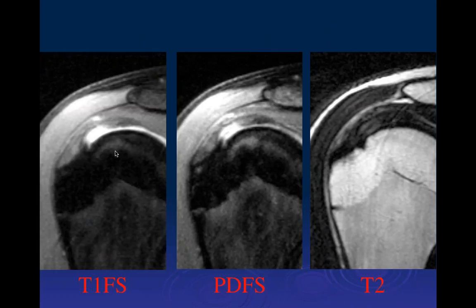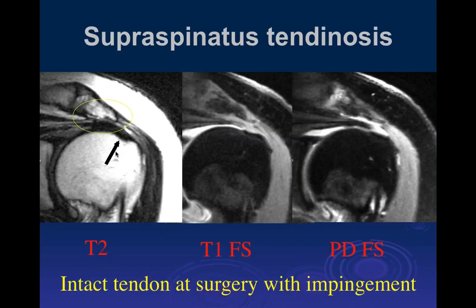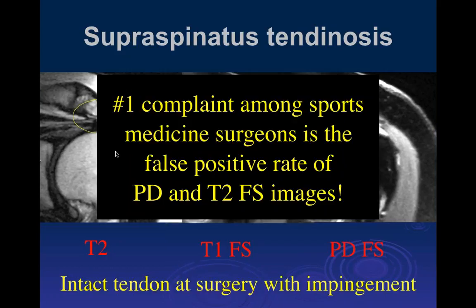Okay, but yes, John. That's why I don't like arthrograms, John. Yeah, and I agree. I'm not a big fan of arthrograms for a couple of reasons. One is I don't think that they help the diagnosis. Some people believe they increase the sensitivity, so people who really want to operate like to order a lot of arthrograms, and we can see that they can increase the false positive rate, I think, more than anything else. But also, if you don't need to, I don't like the idea of putting foreign substances into patients. And why stick a patient and do an injection if you don't have to?